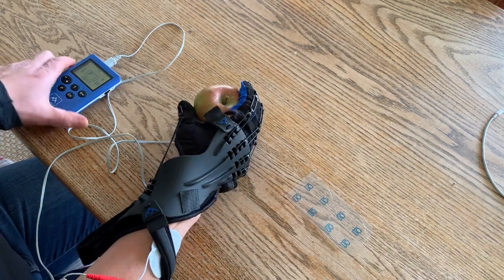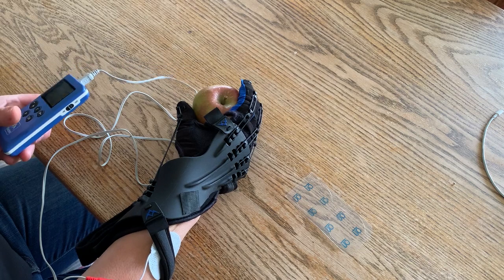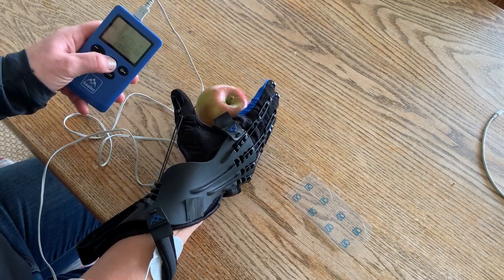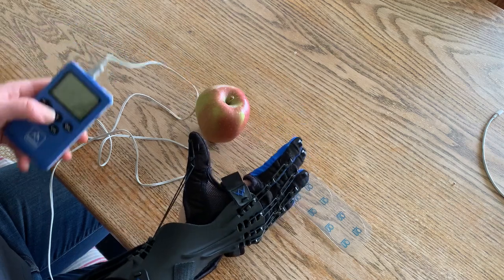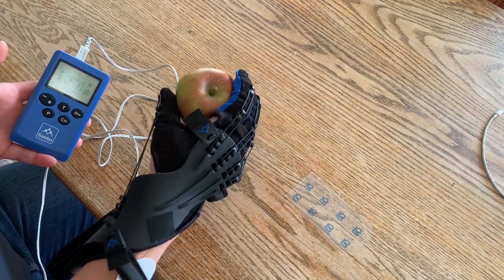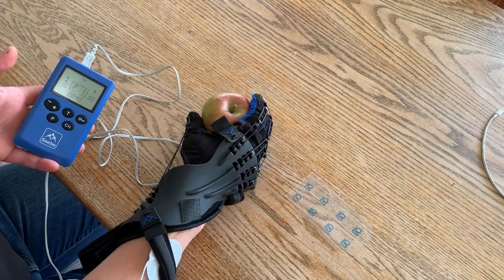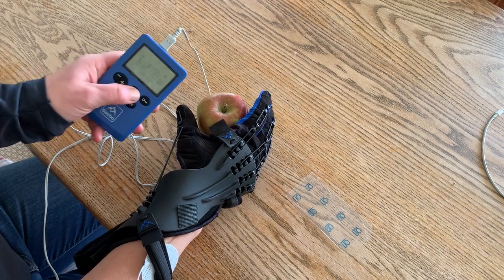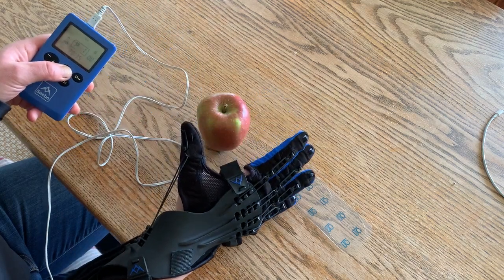When I want to put the apple back down again, I'm going to try and open with the Sabre Glove, but if I need a bit of extra help I'll just press the T button to open my hand. Then nothing's going to happen with the Stim Pro again, so I can pick the apple up. When I want to let go, I'm going to try and work with the Sabre Glove — if I need a bit of extra help, I press T to open up.